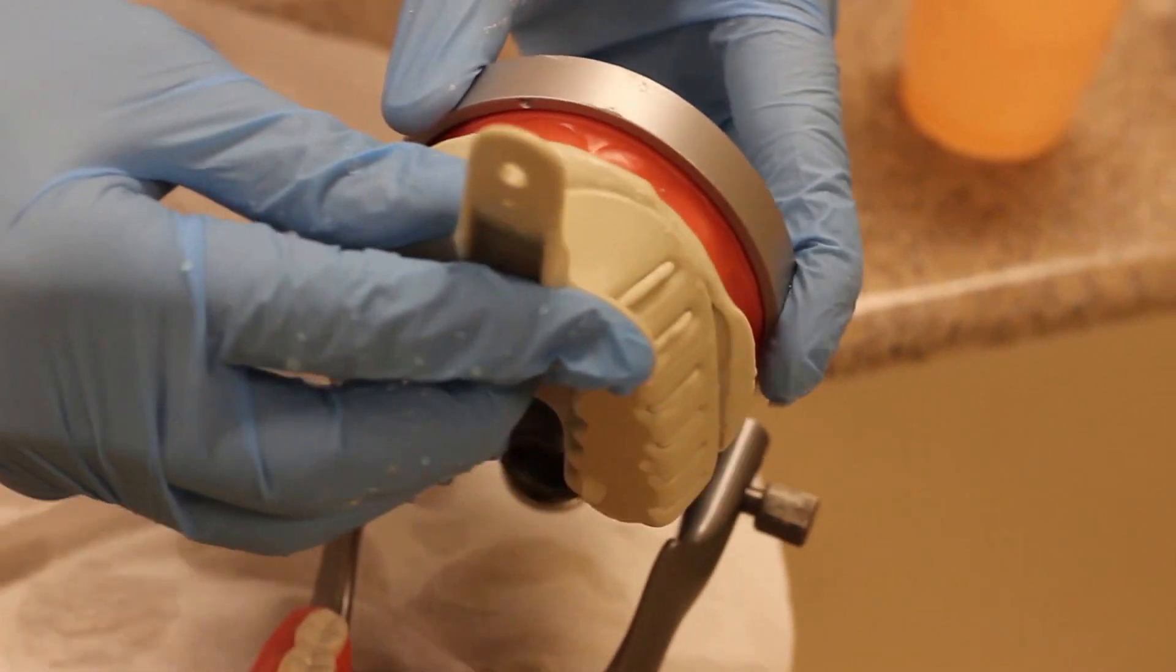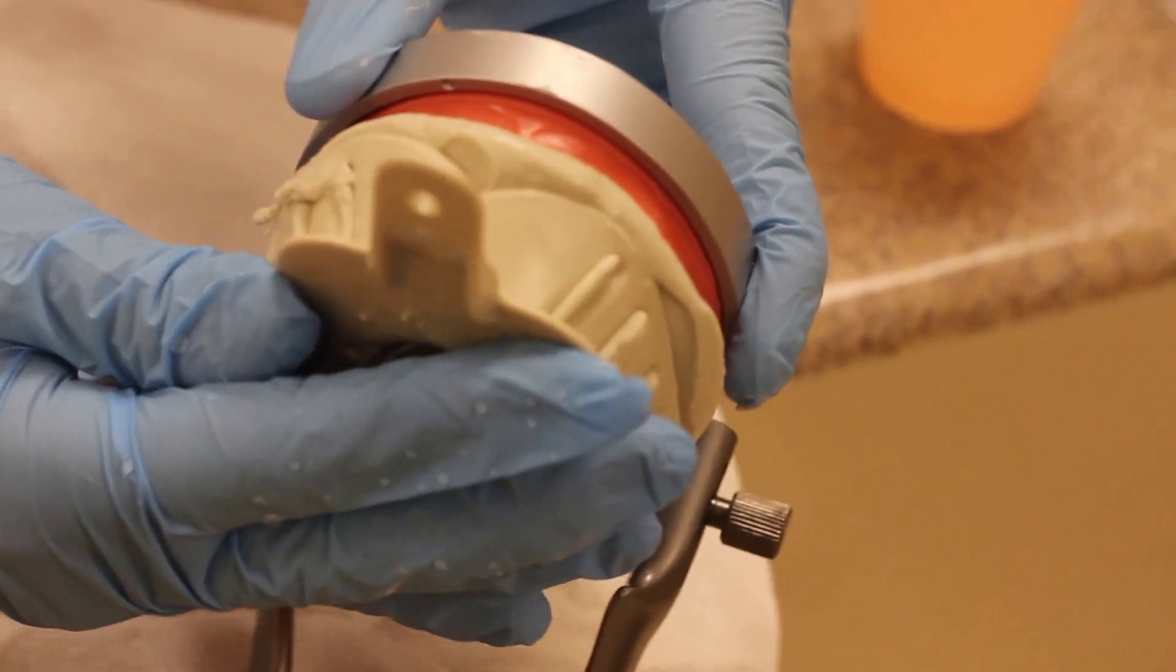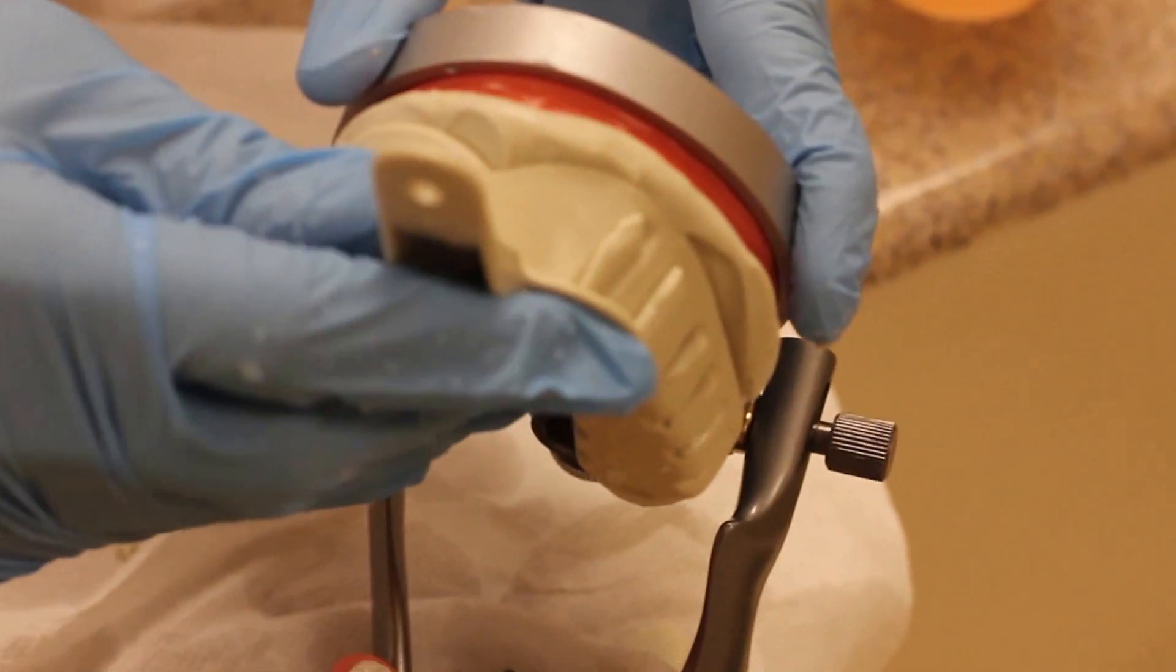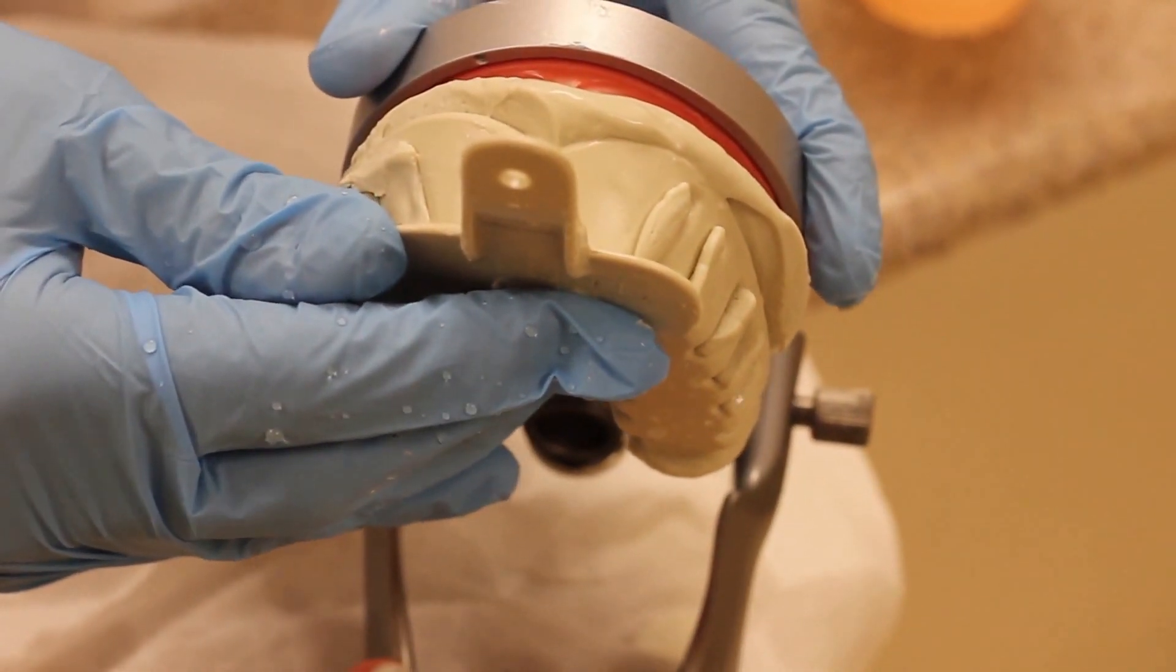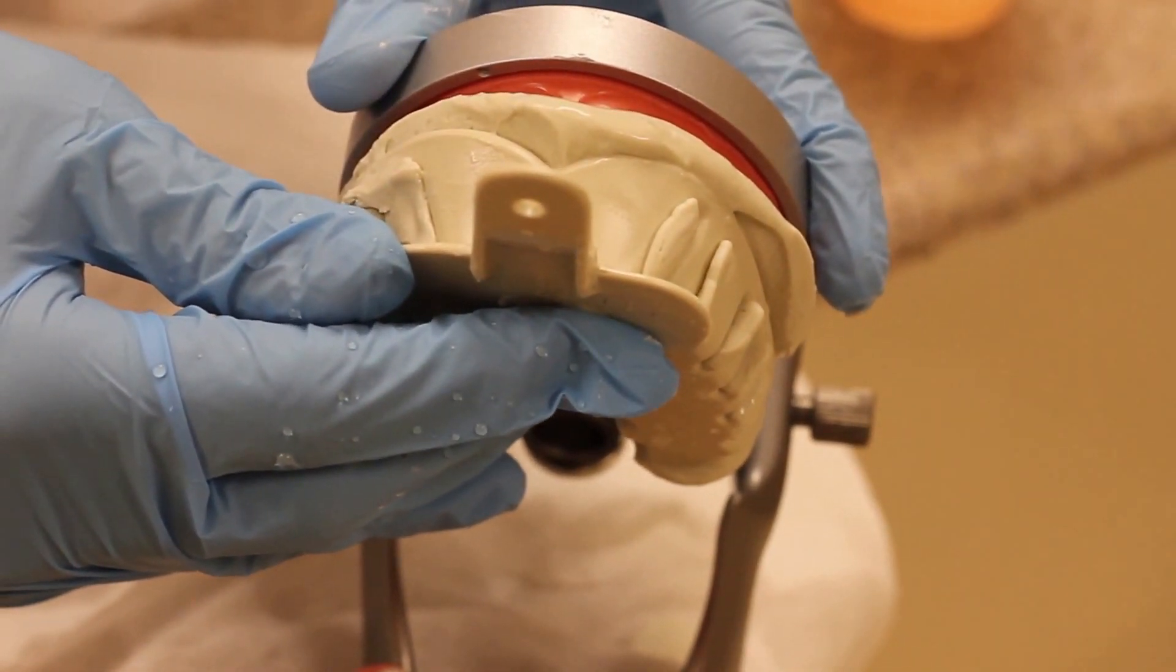And as I seat I like to give it a little bit of a wiggle back and forth because as you put a little strain on that material the alginate will tend to flow a little bit better. And I'll hold that in until it sets.